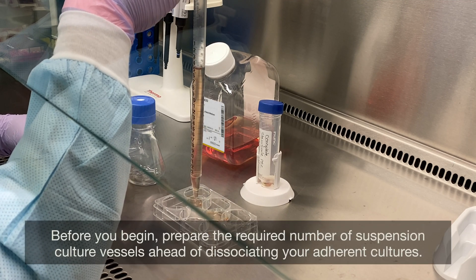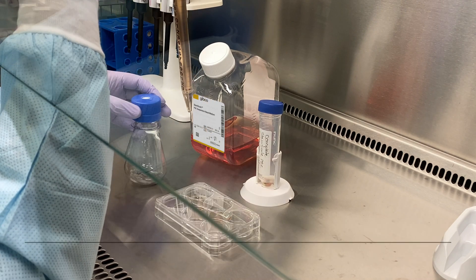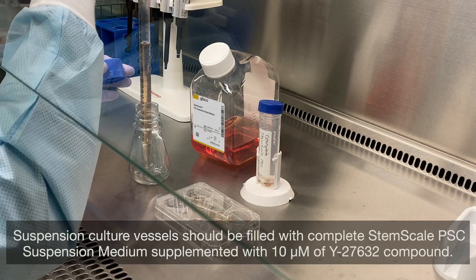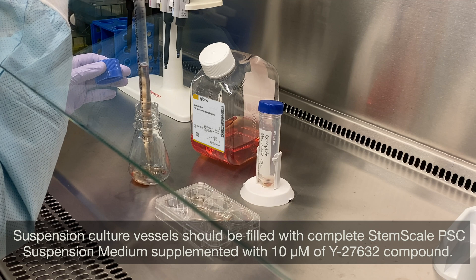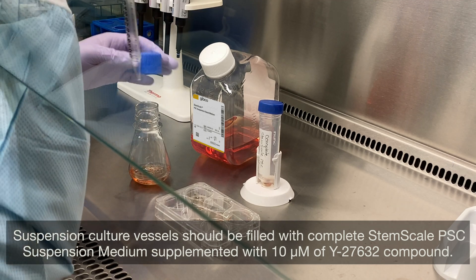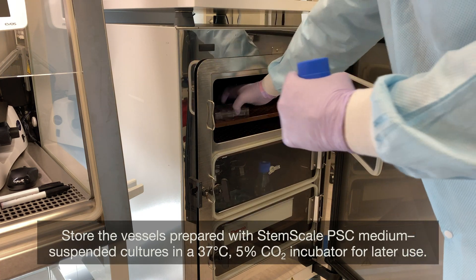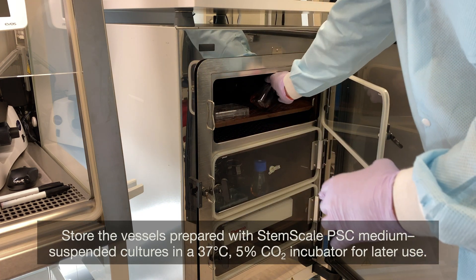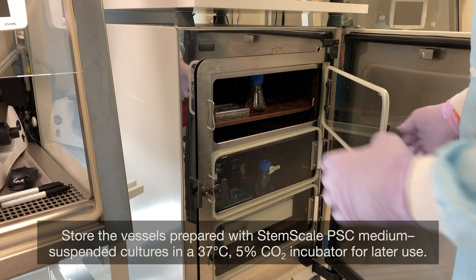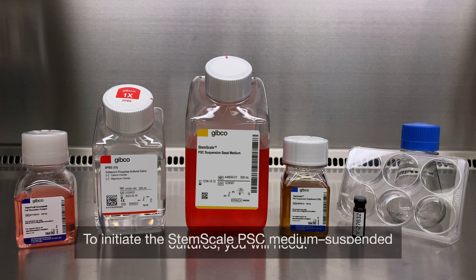Before you begin, prepare the required number of suspension culture vessels ahead of dissociating your adherent cultures. Suspension culture vessels should be filled with complete StemScale PSC Suspension Medium, supplemented with 10-micromolar Y27632 compound. Store the vessels prepared with StemScale PSC Medium in a 37°C, 5% CO2 incubator for later use.